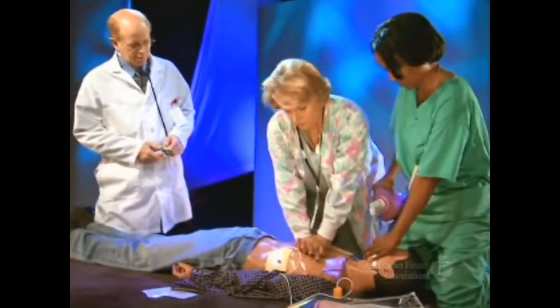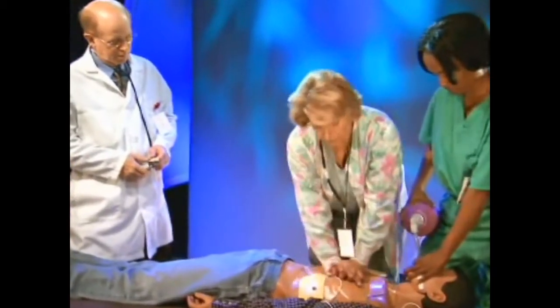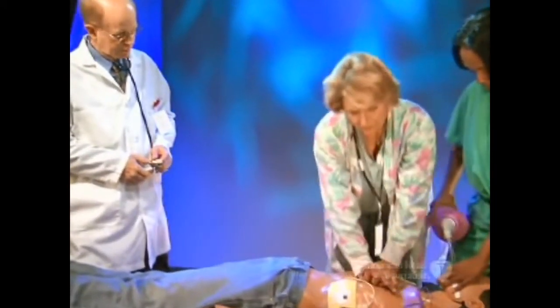So, now you know how to use an AED with two rescuer CPR. CPR is performed slightly different when a victim has an advanced airway, such as an endotracheal tube, combi tube, or laryngeal mask airway in place.